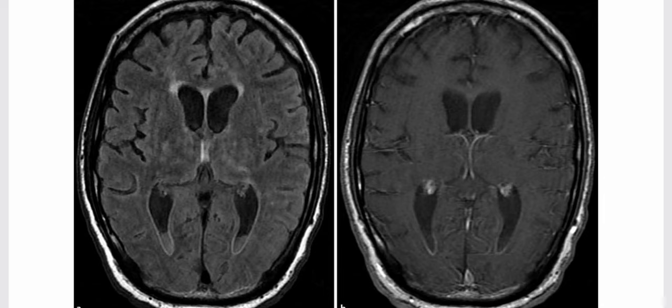So these findings, that is the layering intraventricular debris along with the ependymal enhancement, are quite characteristic for ventriculitis or ependymitis. So the top differential in this case should always be ventriculitis or ependymitis. Other than that, you can add carcinomatosis and hemorrhage in the differentials, intraventricular hemorrhage and carcinomatosis.